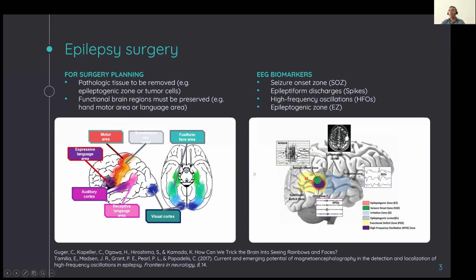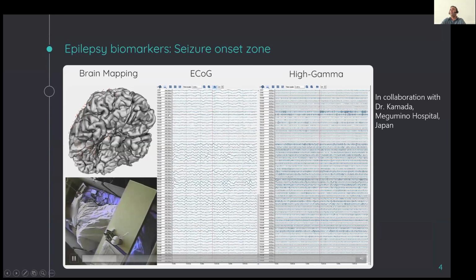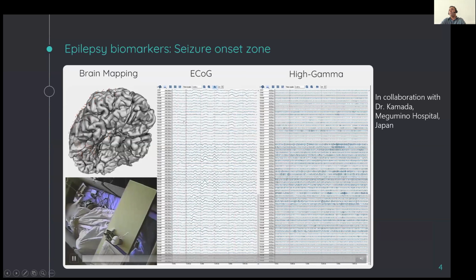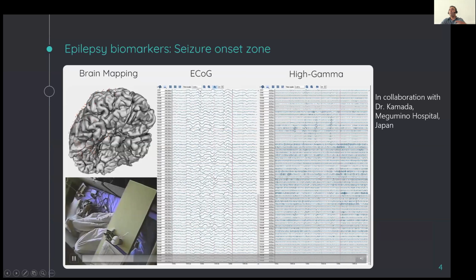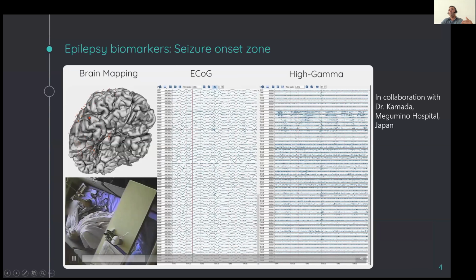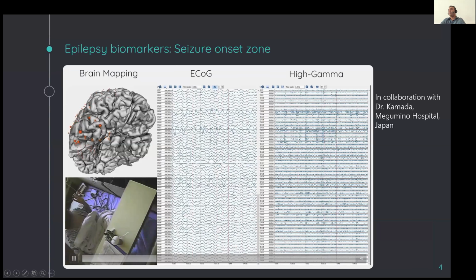In this video, you will see how we can monitor the patient in the EMU. For example, you will wait 10 days or a week. In channel number 105, you will see that the seizure initiated. This area can be considered the seizure onset zone, and it is of interest to the neurosurgeon for doing the resection.